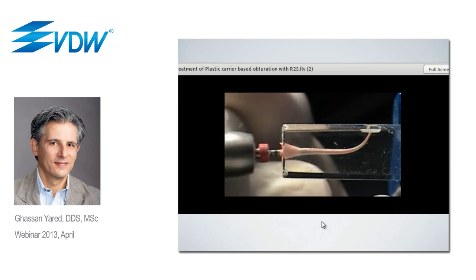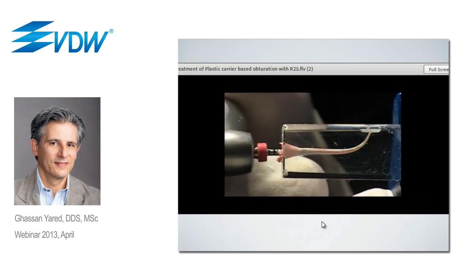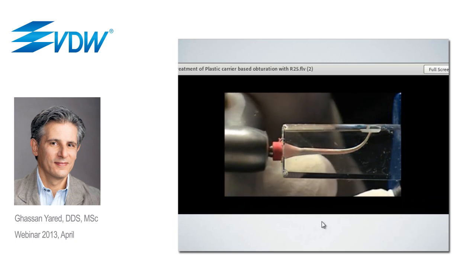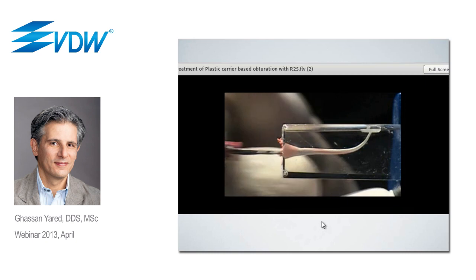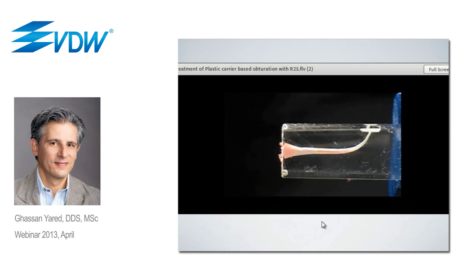And again here, I just want to remind you that regardless of the type of treatment that we are doing, whether it is an initial treatment or a root canal retreatment, whether the canals are calcified or not calcified, severely curved or not severely curved, the technique is always the same. It does not change. And this is what makes it very simple, and very interesting for teaching purposes. It's an easy technique to teach and an easy technique to apply and to learn.